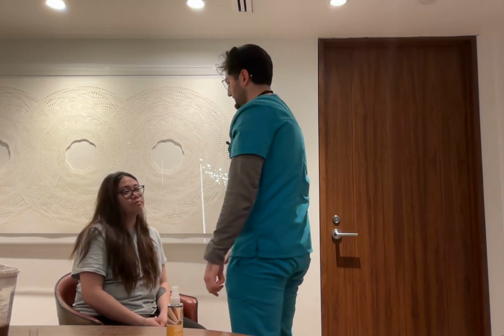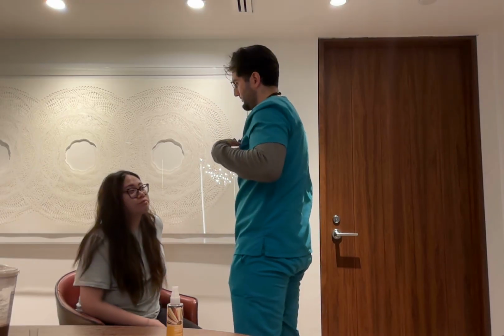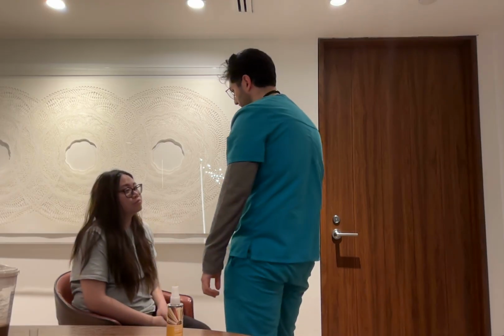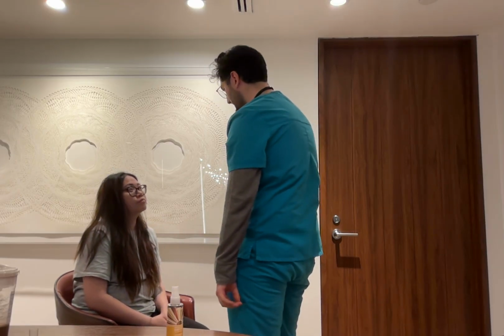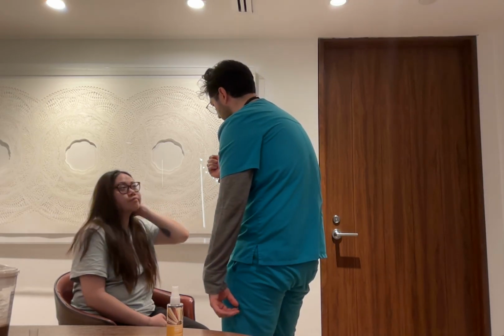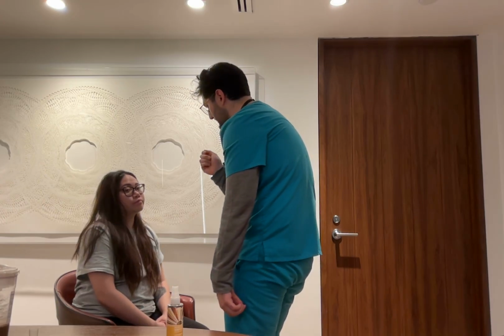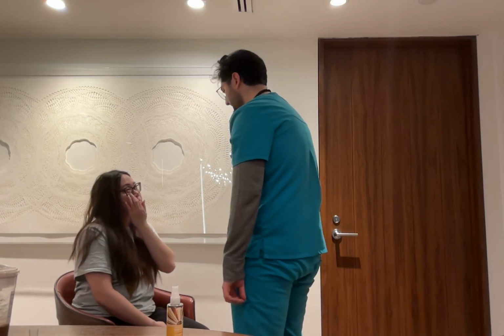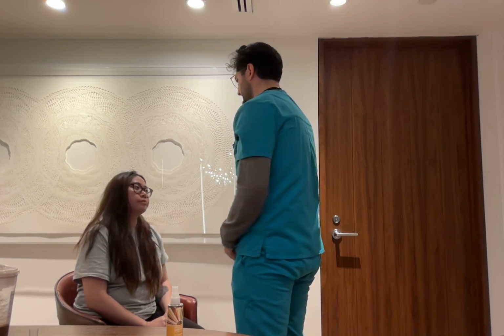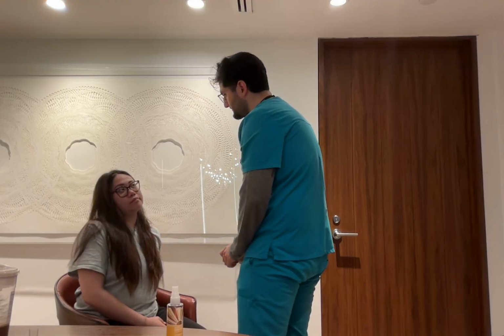Now I would assess the internal structures of the eye with the ophthalmoscope. What I would do is dim the lights in the room. I would get down to eye level with the patient, have them stare at a point behind me, and I would stand about 15 inches away from the patient with the ophthalmoscope at a 15-degree angle away from their line of sight. Assess first for red light reflex and move in, and then assess for the structures of the eye, including the optic disc, the retinal vasculature, and the macula and fovea, which should all be present.